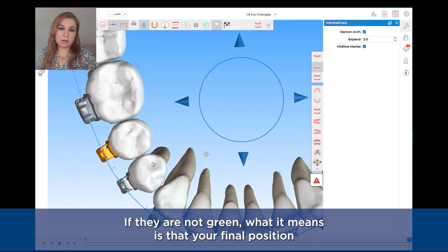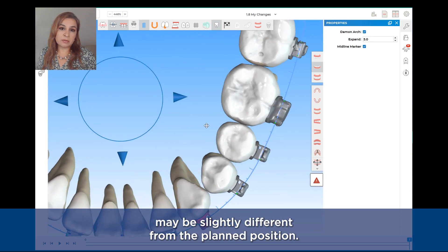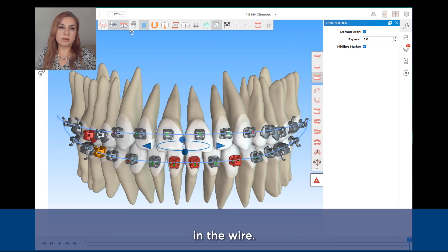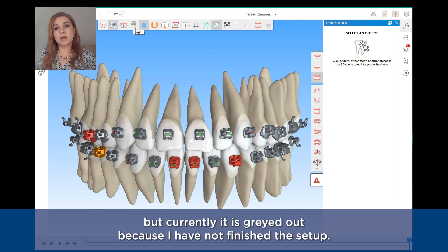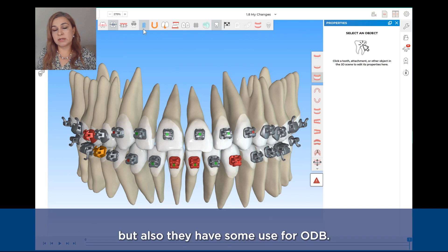If they are not green, what it means is that your final position may be slightly different from the planned position, or you may need to do some slight wire bends. The next button is the jigs, but currently it is grayed out because I have not finished the setup — I will cover that in a moment.